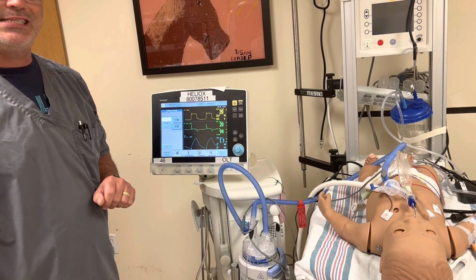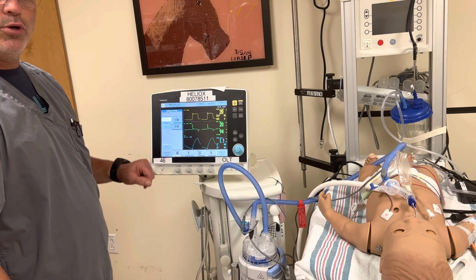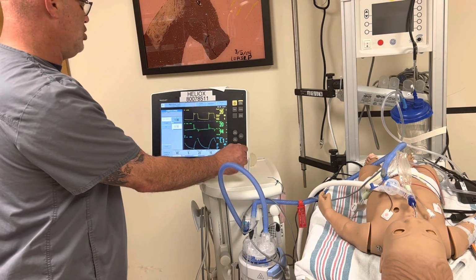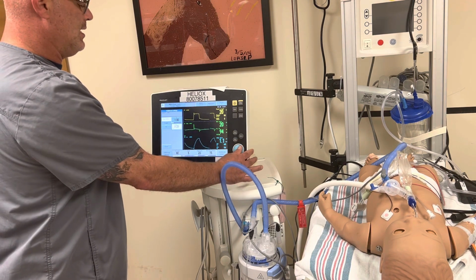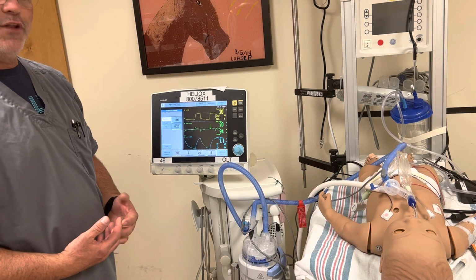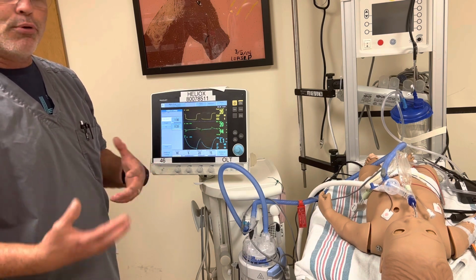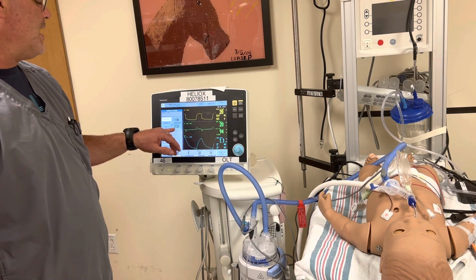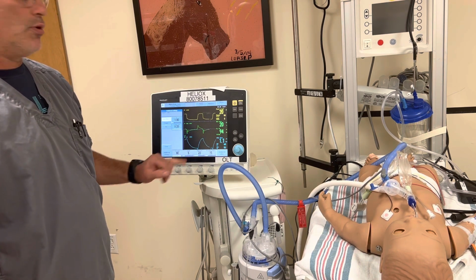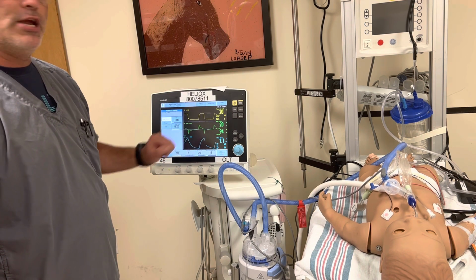Are you going to flush the system with as much flow as you can to get there as fast as you can, which represents 0.000 seconds on the servo? Or are you going to take a more leisurely time reaching that peak? In this setting, the leisurely time would cause the least amount of turbulence in the flow. The faster the flow gets crammed in there, the more turbulence and wasted pressure versus volume occurs. So if I go to 0.2 and make it really slow, now I have a lower peak inspiratory flow, so I'm getting there more sloped. I'm not in a sudden hurry to get to my peak pressure.